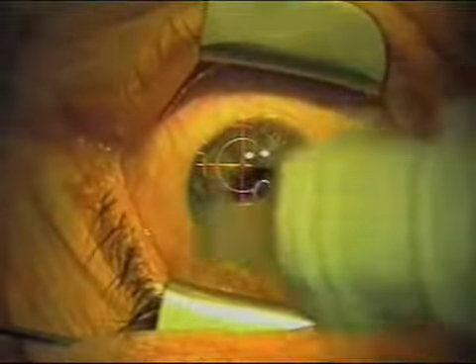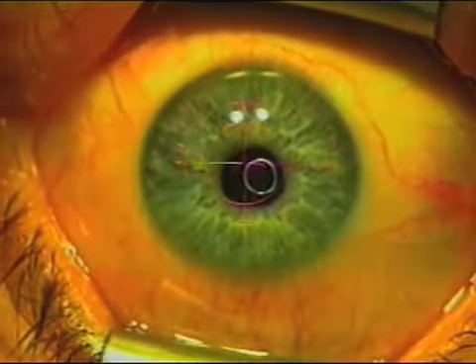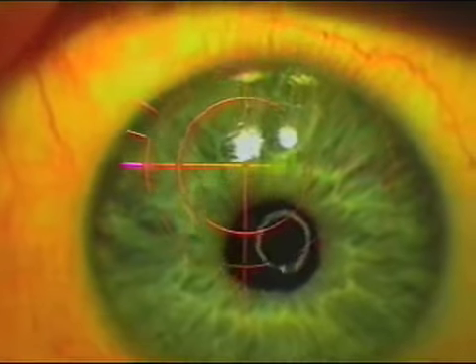In the operating room, I use a closed-bladed speculum, one additional drop of anesthetic. Closed-bladed speculum is useful for any enhancement, just to try to keep the lashes out of the way. And after the extra drop of anesthetic, I'll typically dry the extra material off of the surface of the cornea with another moist Merocel sponge. It also allows it to be a little bit easier to identify that cut edge, and you can see it down at the 6 o'clock position.